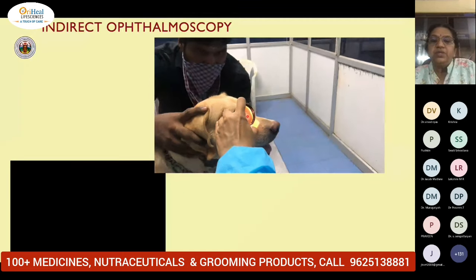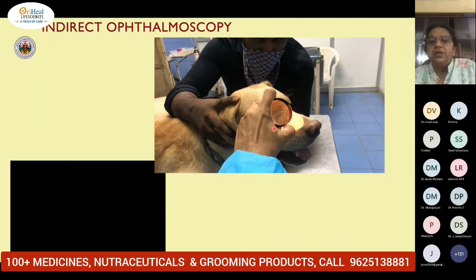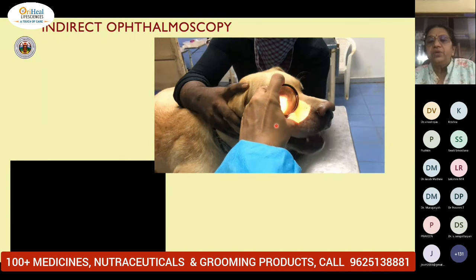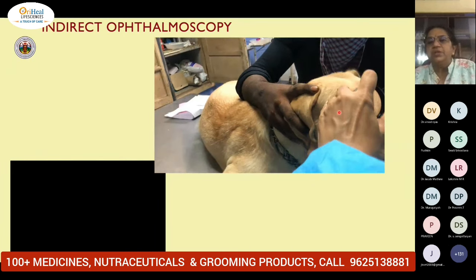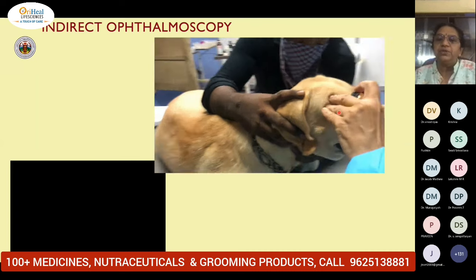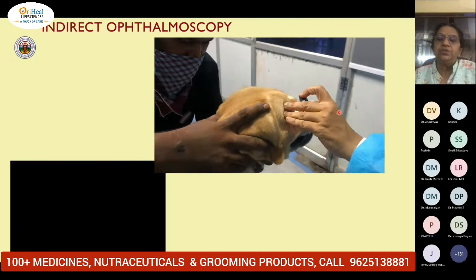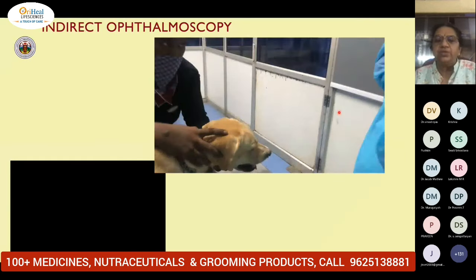And now with the help of only the forefinger and the thumb, I am trying to move the condensing lens back and forth to get the image in focus. Even if the image is in focus, sometimes you also get magnification while doing so. So you're not supposed to take your hand away while doing this. When the animal moves, you also have to move along with the animal.